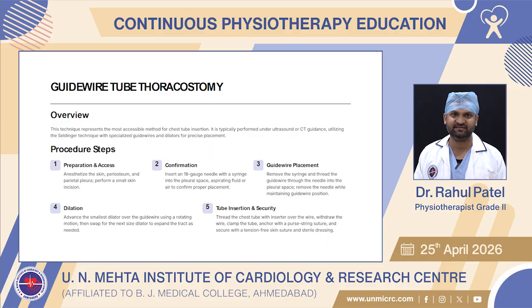Fourth, dilatation. Advance the smallest dilator over the guide wire using a rotating motion. Then swap for the next size dilator to expand the tract as needed.